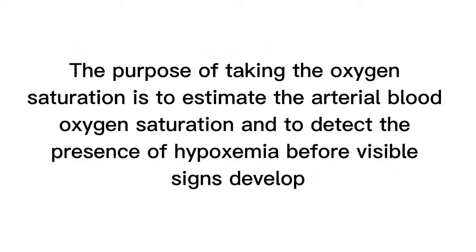The purpose of taking the oxygen saturation is to estimate the arterial blood oxygen saturation and to detect the presence of hypoxemia before visible signs may develop.